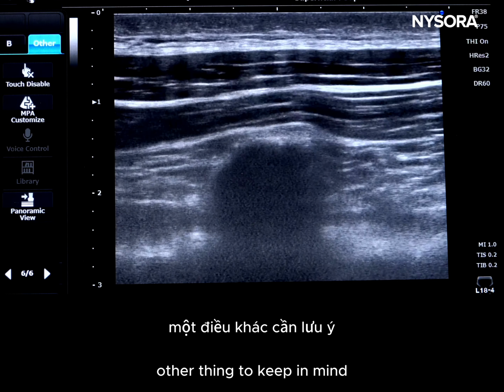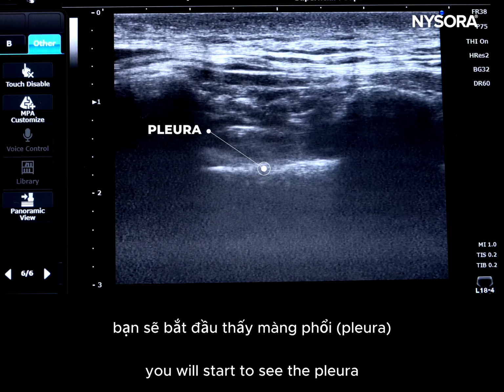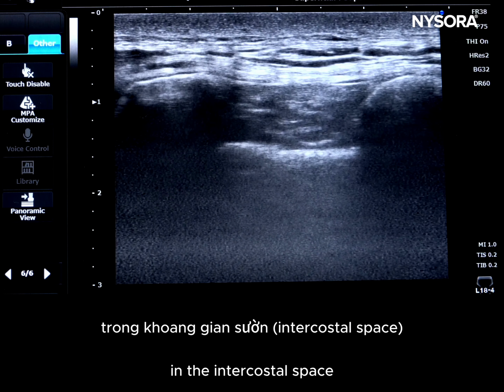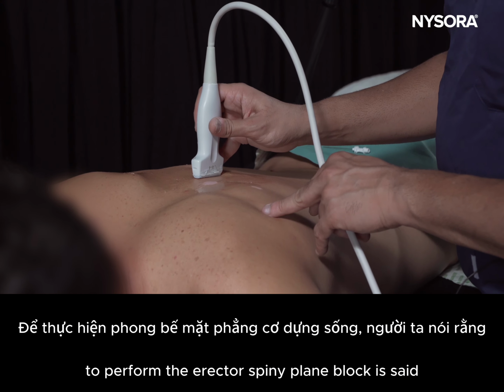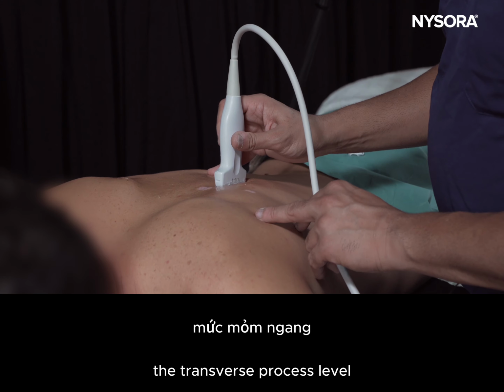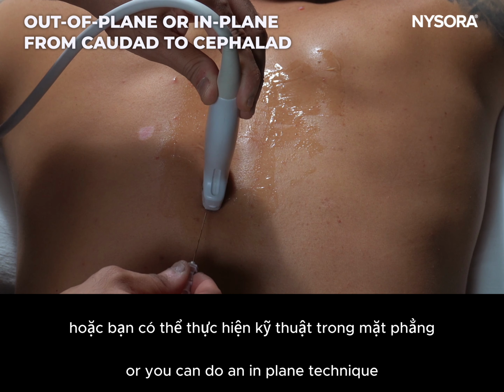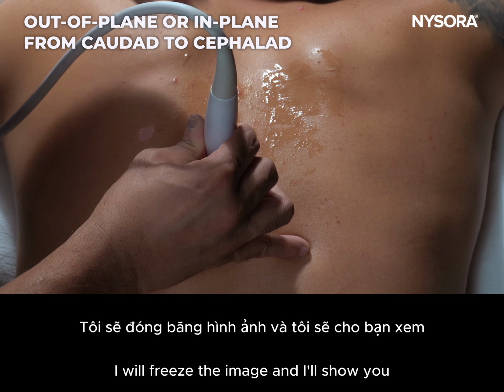Other thing to keep in mind, when you're looking at the rib level, you will start to see the pleura along with the intercostal muscles and the neurovascular bundle in the intercostal space. To perform the erector spinae plane block, as I said, once you have reached the transverse process level, you will bring the needle. Either you can do an out of plane technique or you can do an in plane technique. I will freeze the image and I'll show you.